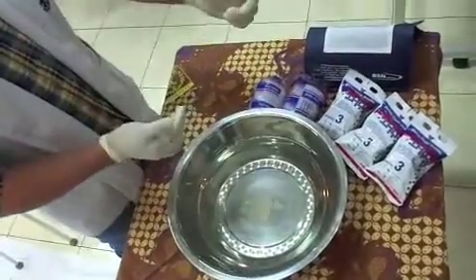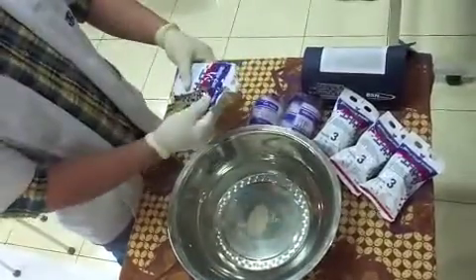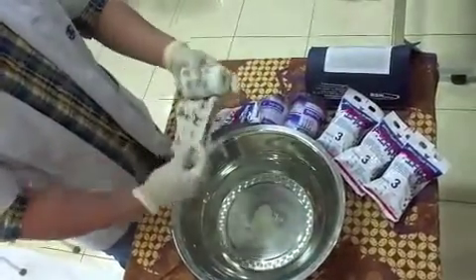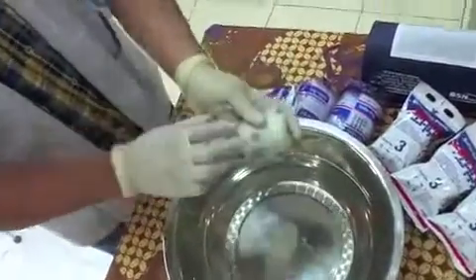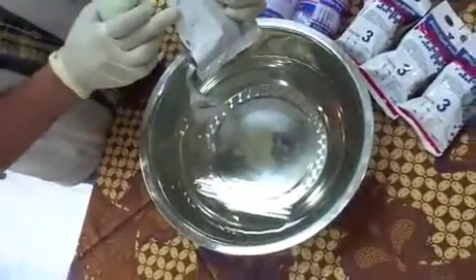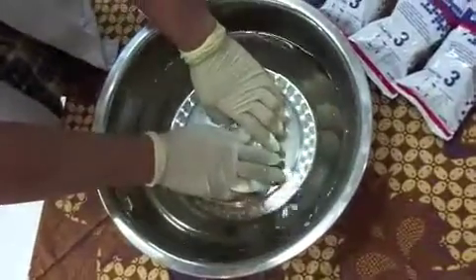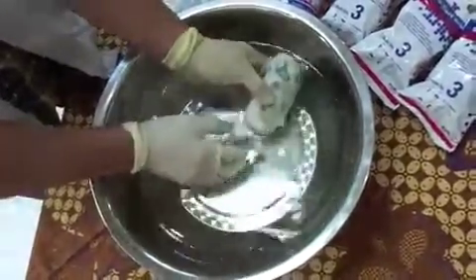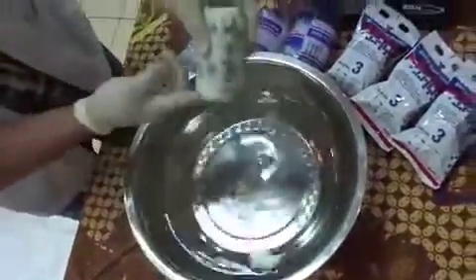In this technique, we only use one Delta Cast Print and it has a unique feature — it is quite elastic, so after applying the cast the patient will be comfortable. We soak it in water evenly and then squeeze a little bit to remove the excessive water.